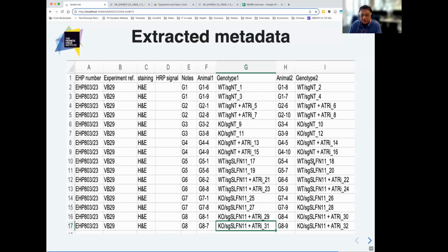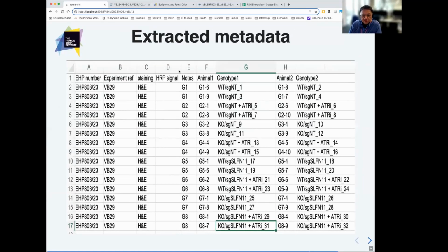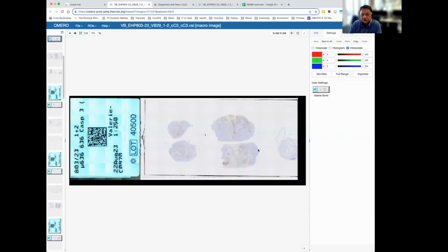So it becomes obvious that it is not easy to annotate data based on, for example, this slide, which has 3 different tissues. One is control, whereas the other 2 are the main tissues, and how to explain it in a way that systematically we can utilize it for, for example, machine learning or accessing it and things like that in the future.